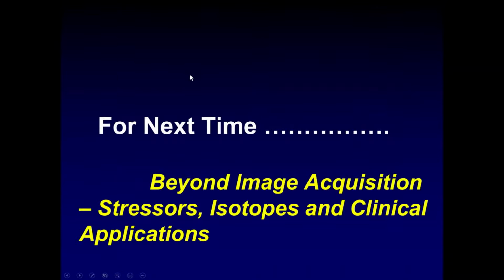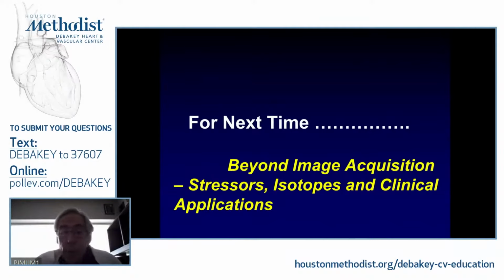So it's just about 1 o'clock, and I'm just about done. But I hope you have a much better idea of, in terms of the radiotracers we use, what affects photons getting out of the body, such as scattering and Compton scattering, how we try to eliminate those problems by using collimators to only accept good photons that are coming directly parallel from the patient to the sodium iodide crystal, and how even when photons get to the crystal and undergo scintillation, we can still use other corrections using our pulse height analyzers to only take those photons which are the right energy, which therefore would be the right photons that came directly off the patient, and how we can then take that raw data, process it, and use different filtering to get an adequate picture.